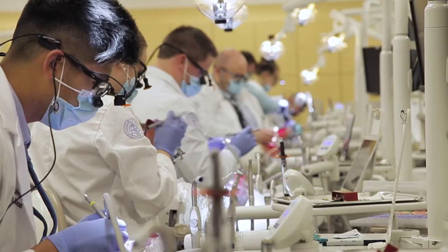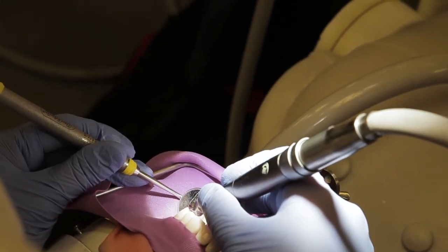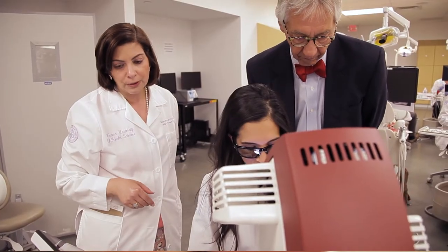Traditional teaching models right now just involve mannequins and plastic teeth. The Moog Simodont is a virtual reality haptic simulator. It has the look and feel and touch of an actual clinical experience, with the ability to approach various disciplines through the simulator.